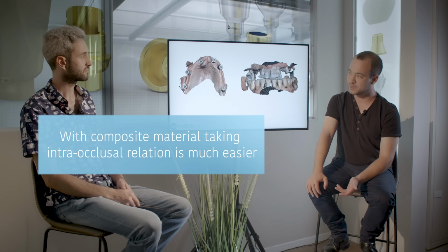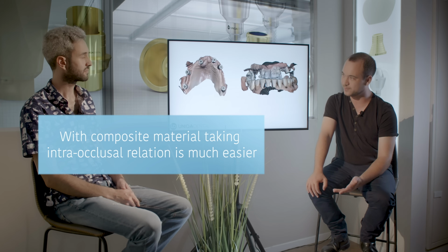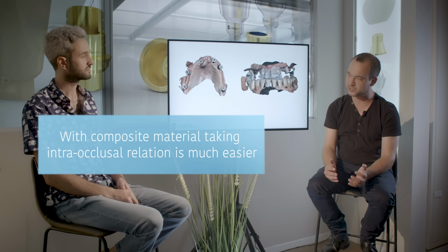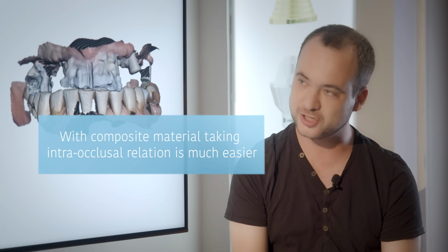So here, some of the scan abutments we covered with composite material. The greatest advantage of the composite material is it's very hard, so the patient closes his mouth each time exactly the same. When you use wax, you have this problem, because it deforms. Each time he closes his mouth, it closes a little bit different.